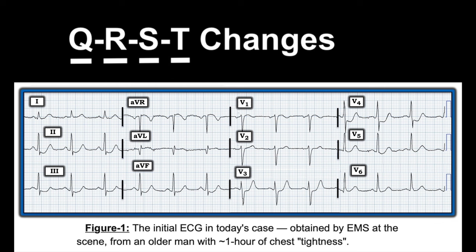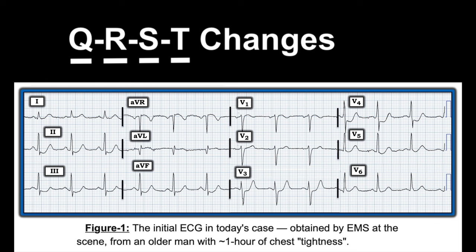Now for ST segments and T waves: there is ST depression in each of the inferior leads with an upright, tall terminal T wave. ST depression begins in leads V3 through V6, and is greatest in V3 and V4, where the T waves are also very tall. Importantly, the ST segment in V2 is isoelectric — not elevated — but normally V2 should have a slight amount of ST elevation. This is not normal; it should be a little elevated.